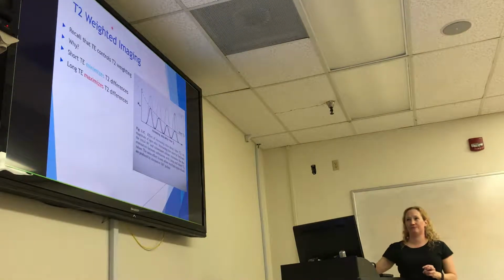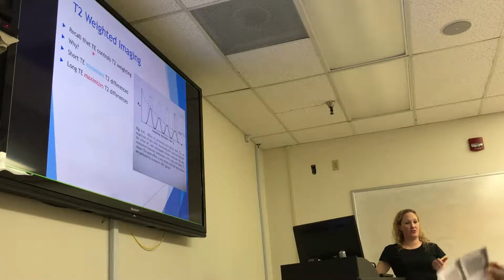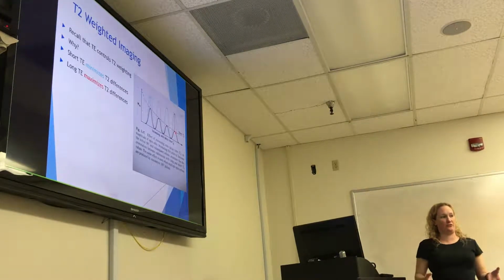T2 weighted imaging. So again, recall that we talked about this last week. The parameter that controls our T2 is our TE, and the reason for it, again, we can see here that our short TE minimizes those T2 differences. So for a T2 weighted, we need that long TE because we want to maximize those T2 differences, maximize how much dephasing has occurred in our tissues.